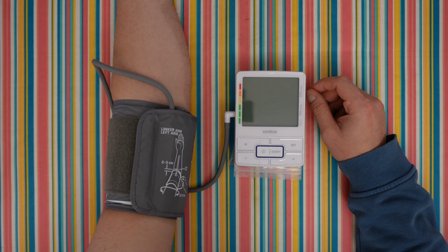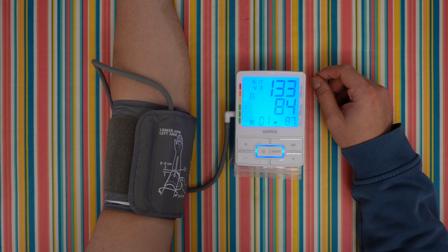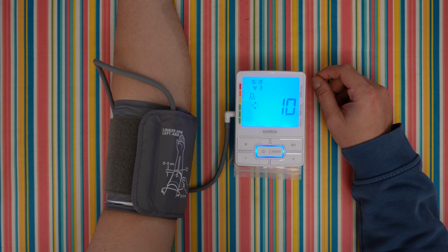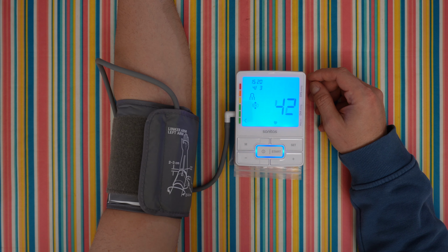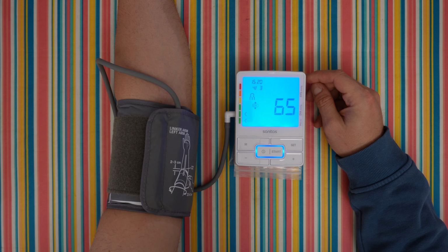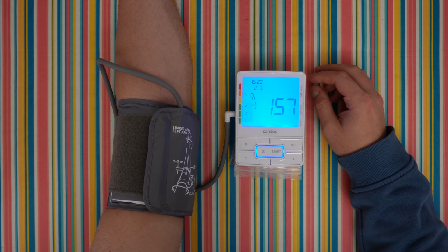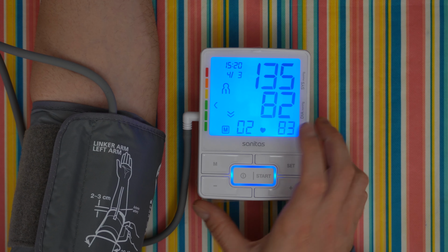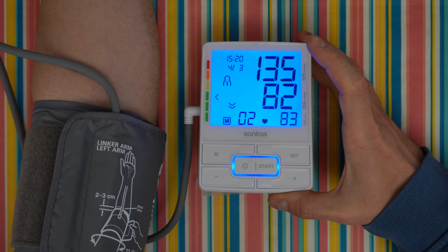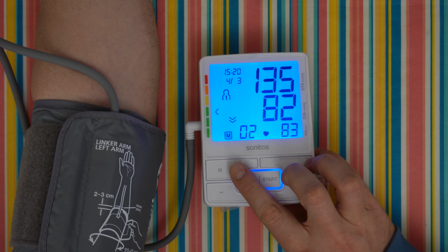Let's start again. It will switch off, switch on, first user, start. Here is the cuff inflation icon. It says OK. The heartbeat. I need to be calm, not talking. I'm talking right now. Again, we then have the second measurement. So easy to do that. I'm sorry if the display doesn't look so well because I need to find the correct angle. You can see here the letters are showing better. Okay, let's try again.